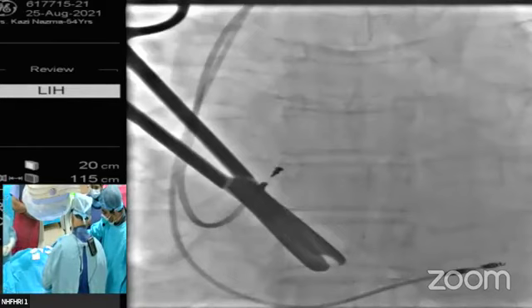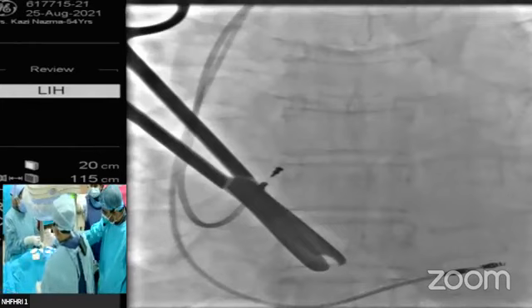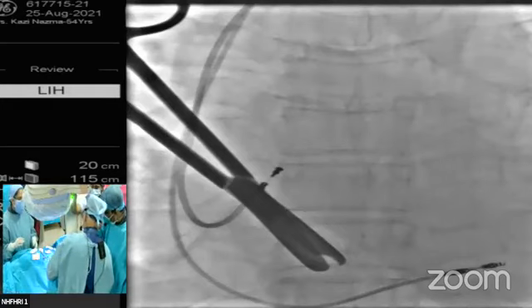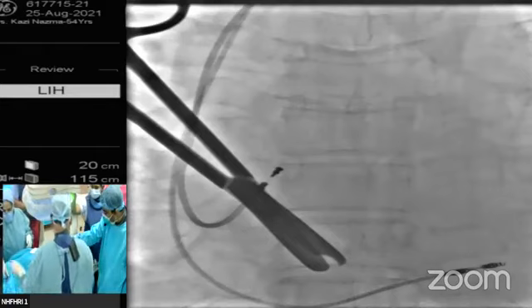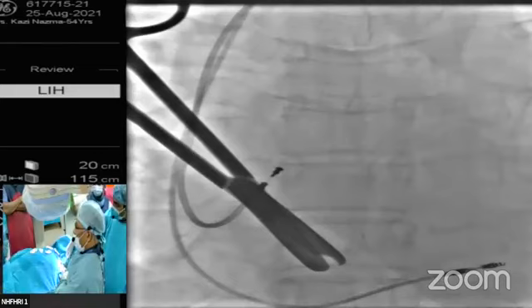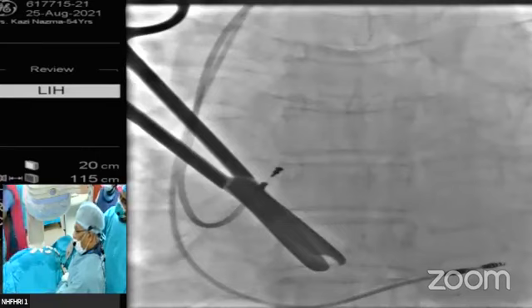If the patient is post PCI, on aspirin and clopidogrel, Dada, what is your strategy? Usually, if it is within 3 to 6 months, I used to continue both aspirin and clopidogrel. I am asking, if the patient is post PCI on dual antiplatelet therapy and you have to do a permanent pacemaker, what is your strategy? With dual antiplatelet, we used to do the procedure. Even sometimes patients with 2 aspirin and 2 clopidogrel, we used to do it.